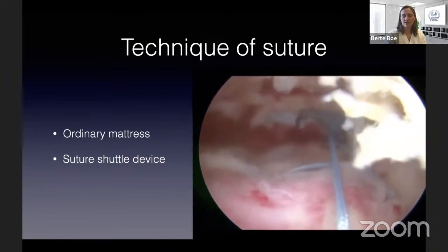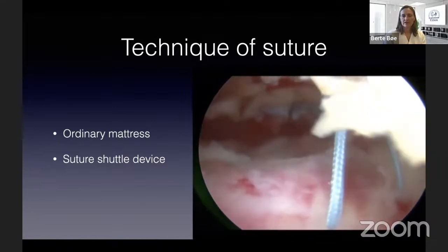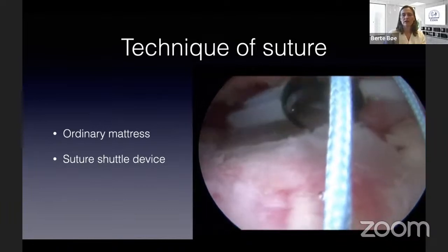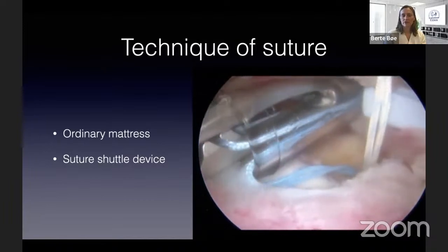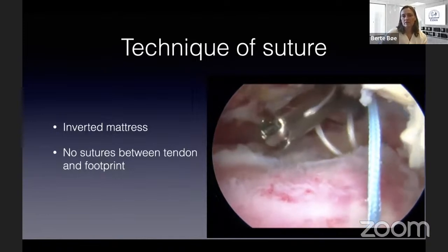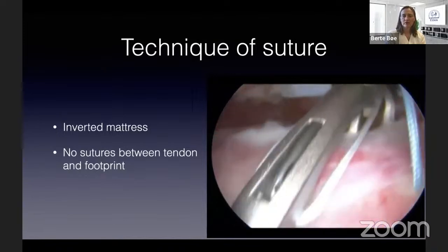So even if this is also called a single row, the mattress sutures can be placed in a crossway fashion, and they can be placed inverted. I will show that in a minute. And also you can do a kind of Mason Allen technique with your suture, and that's kind of advanced single row compared to those totally easy. So here is an inverted mattress.